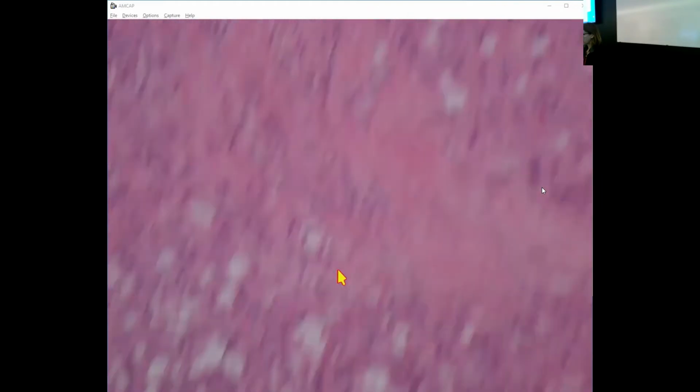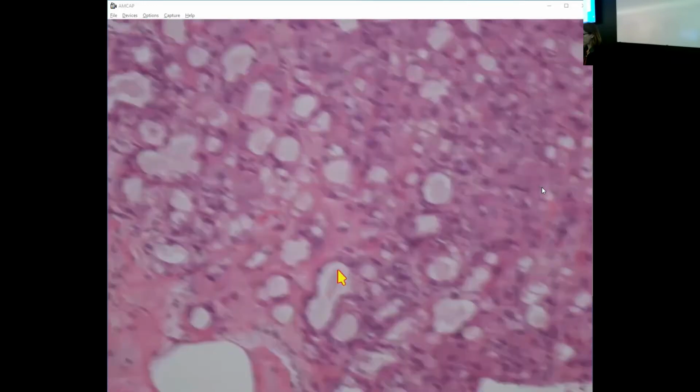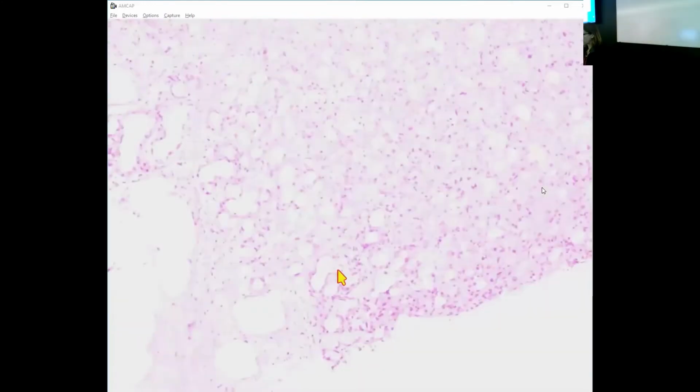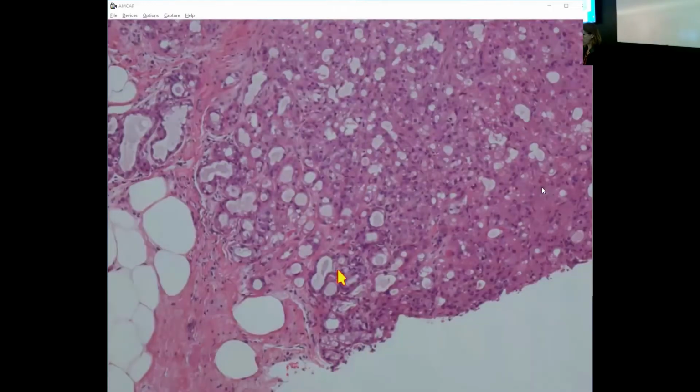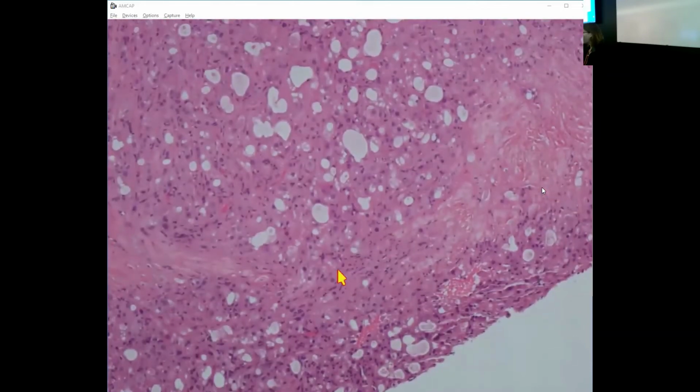So for apocrine DCIS, as I was saying earlier, what I look for is areas around the adenosis area, and look for the cribriform pattern or micropapillary pattern or something that looks more fully developed as architectural atypia to go all the way to apocrine DCIS.